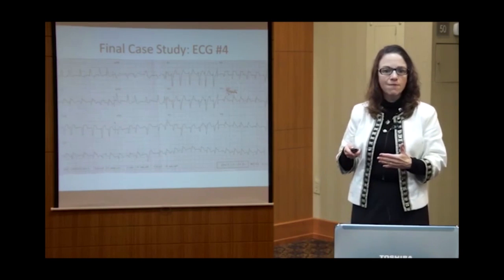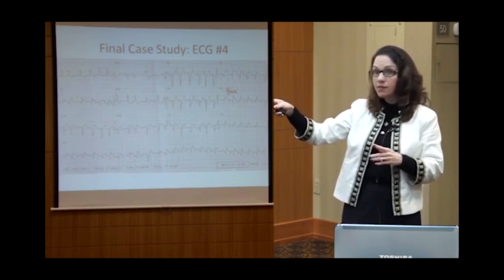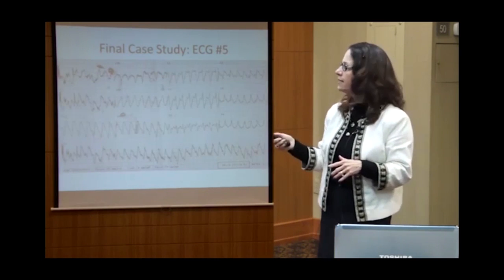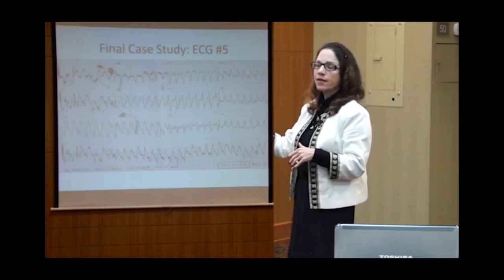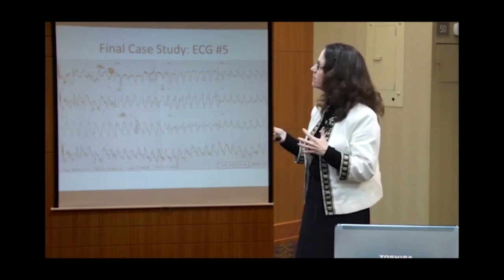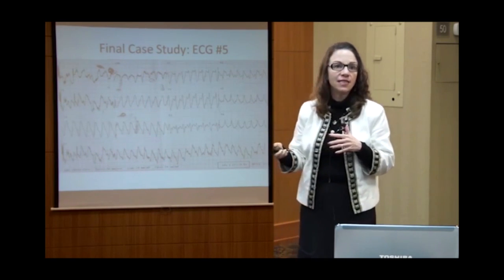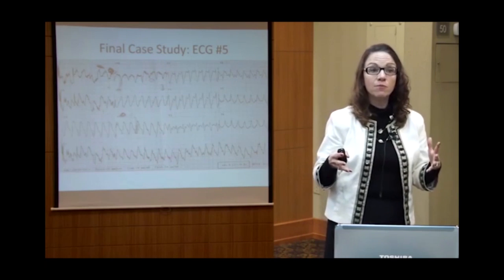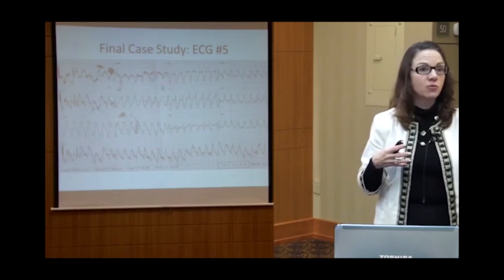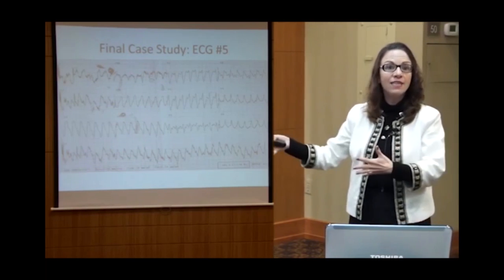And as I was walking back into the room, I looked up at the monitor in the hallway from that consult room to his room, and this is what I see in lead V1. Now, it's negative in V1, so when it's negative, we're concerned about R waves and downstrokes. Do you see that I now have a fat little R wave in V1? Now I know this is VT. So I walk in the room, and the two cardiologists were actually on the phone talking about other pages that they had gotten, and I said, hey, VT.